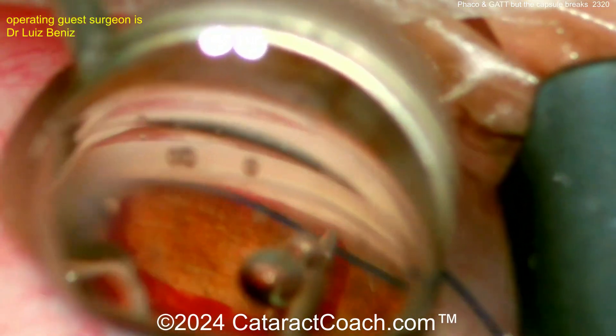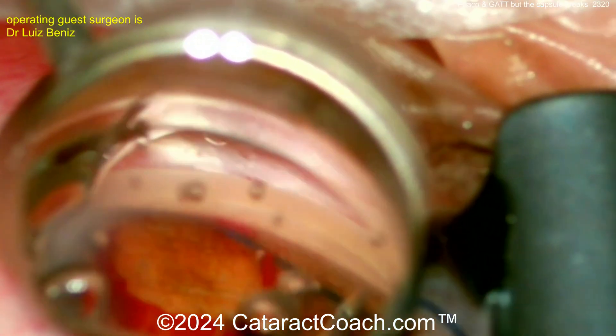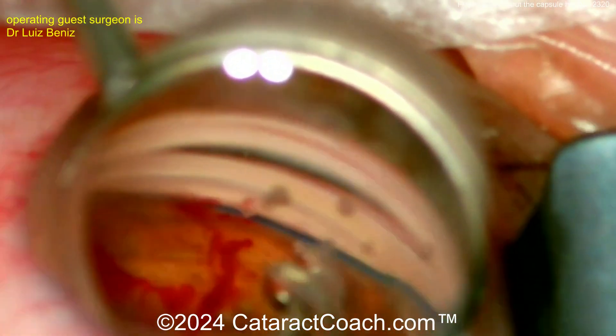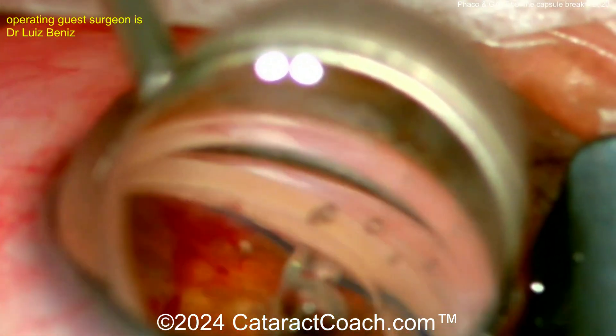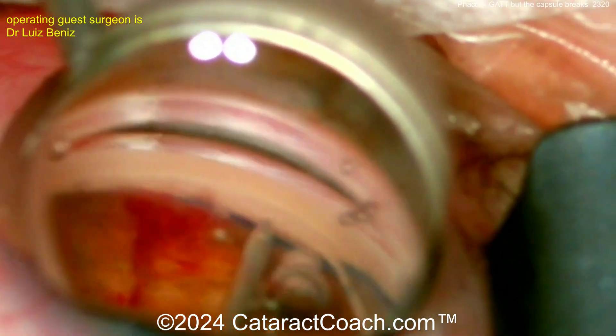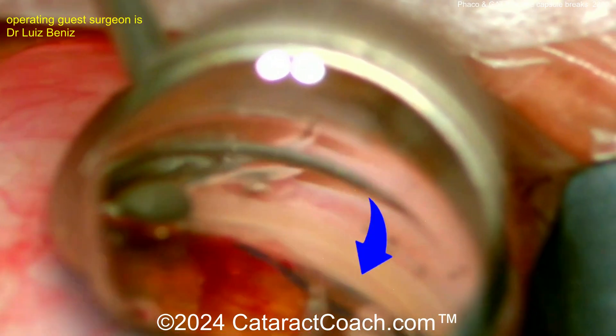Pulling it through — very nicely done. Keep advancing, advance, advance, advance. In this case, even though there was a posterior capsule break, fortunately it was small. There was no vitreous prolapse. The anterior hyaloid face was intact. And even if you couldn't get that posterior rhexis done, it doesn't really matter. You put your lens in the bag, and that lens — the optic itself — acts as a barrier.